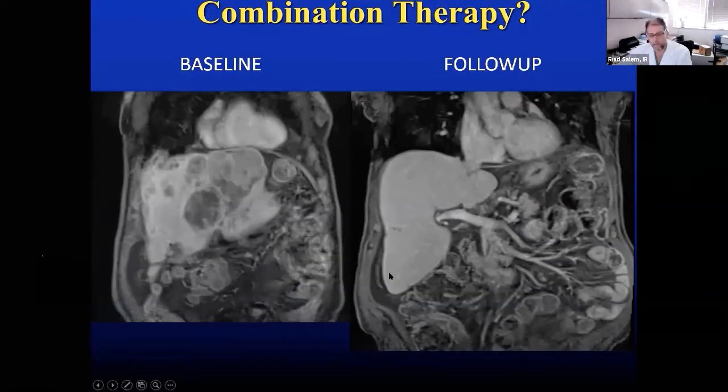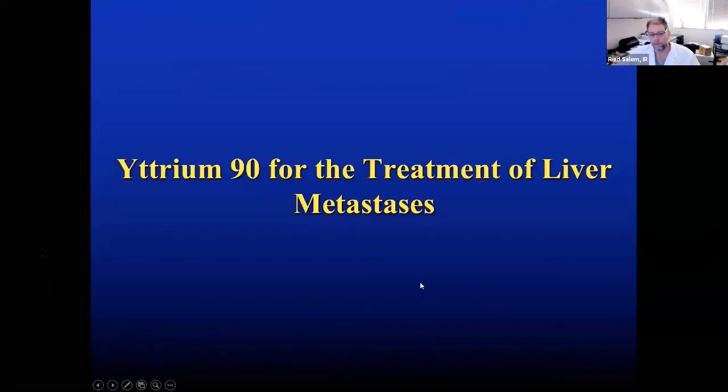Alex will be talking about immunotherapy in HCC later on, but here's a great case that we had of combined Y90 immunotherapy. This is pretty impressive, and this is something that we'll probably be writing up. This person, in fact, had extrahepatic metastases at baseline. After Y90 immunotherapy, the metastases disappeared. A small recurrence was resected, and he is doing well 3 years later.